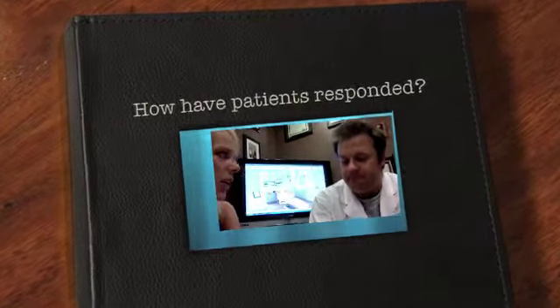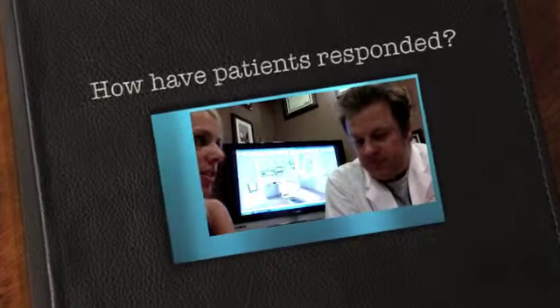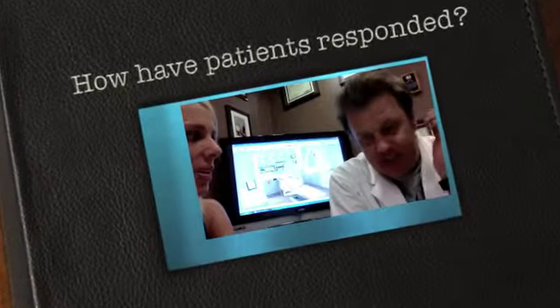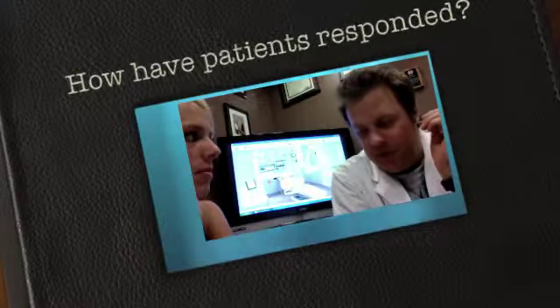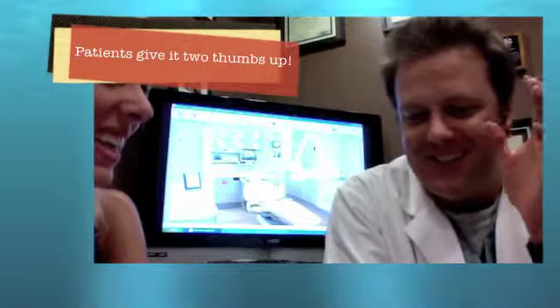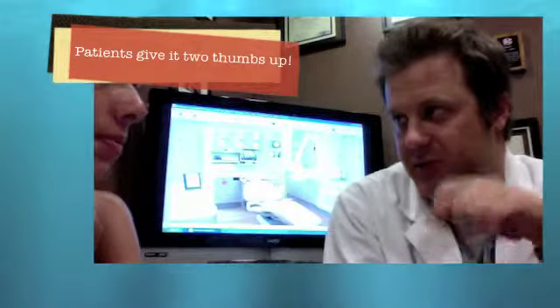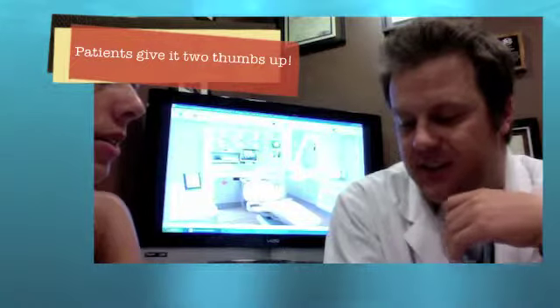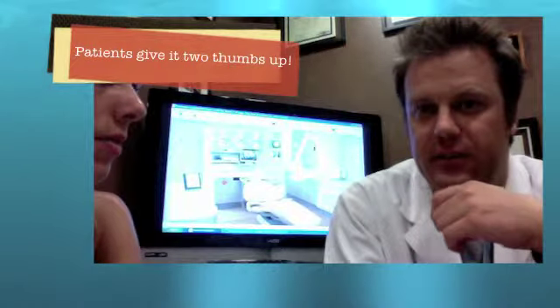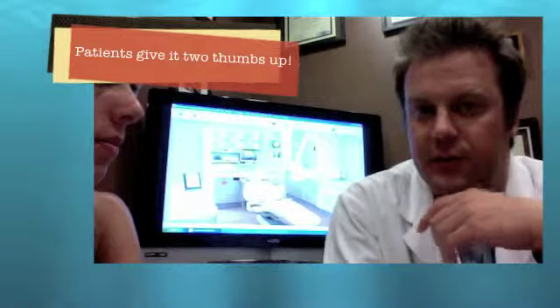This can tag right along with that. What have patients' responses been to this new system that you're using? Patients like it. Number one, everybody likes technology, so it's super high tech. The cool thing is I don't give shots. I don't have a syringe that I give shots with, and we use that wand. It's a computer that gives the anesthetic and a computer to scan their teeth into. So patients just value what I do more.